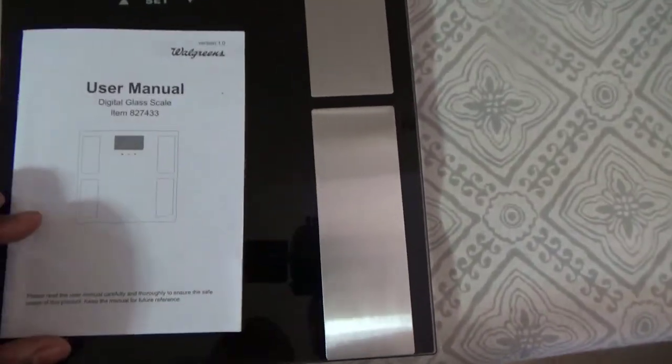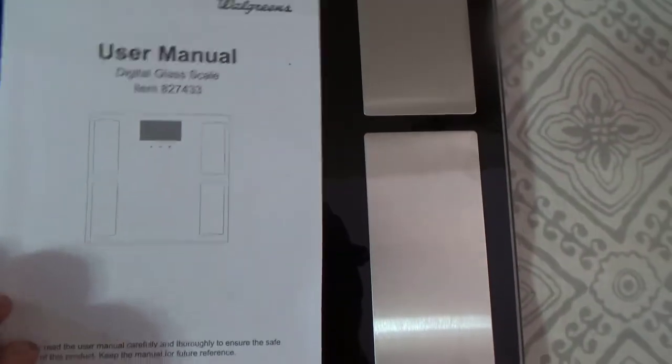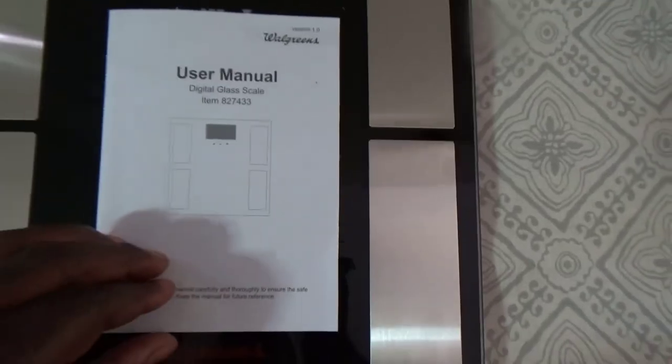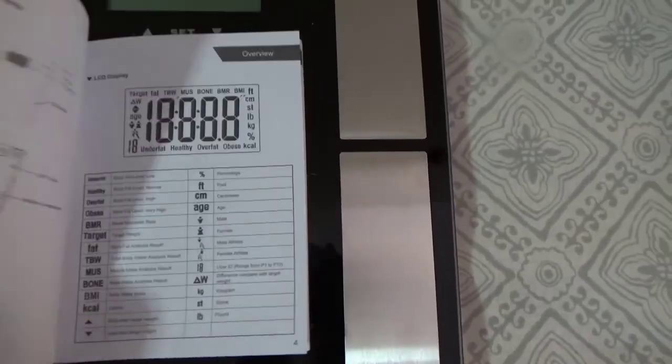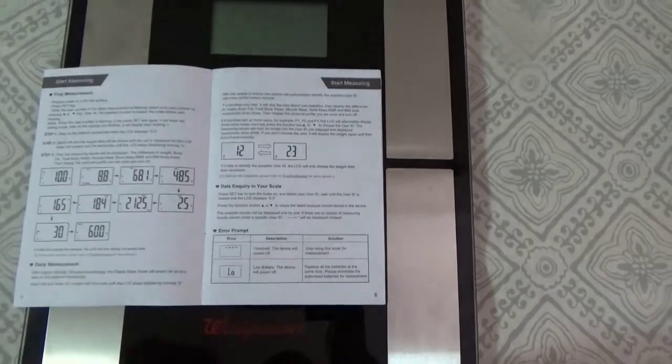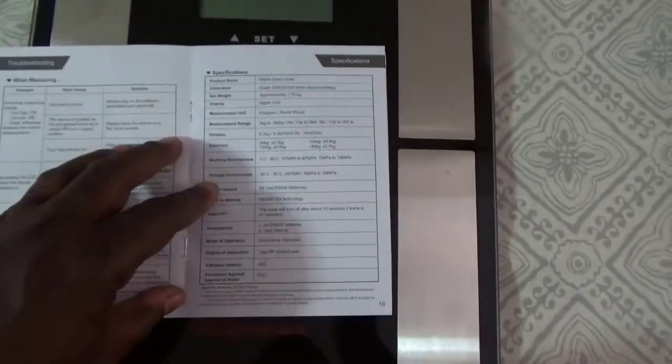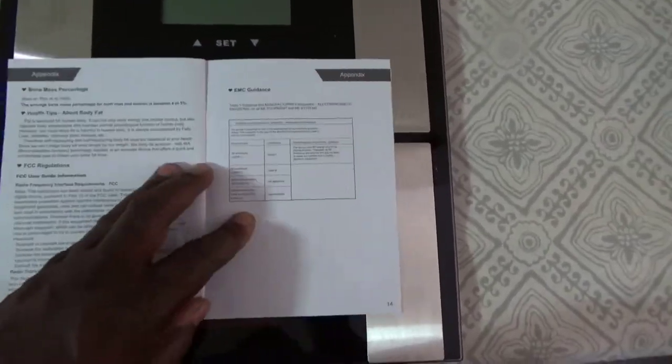It comes with these instructions and the instructions are real simple, but you can put these instructions to the side because I'm gonna show you how to do it. If I can do it, you can do it.